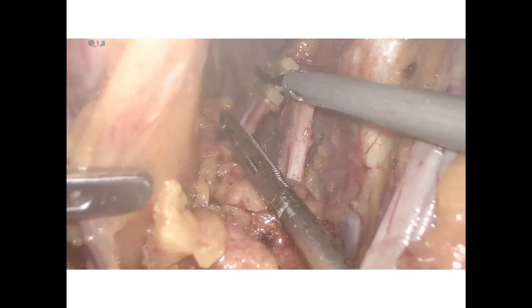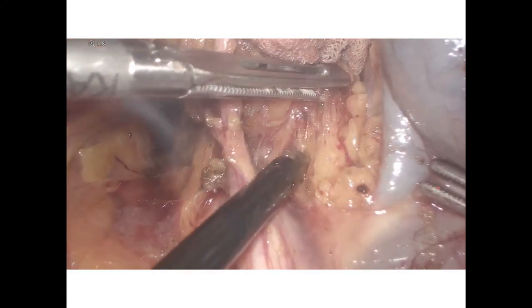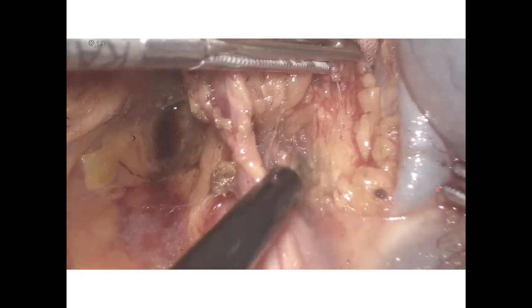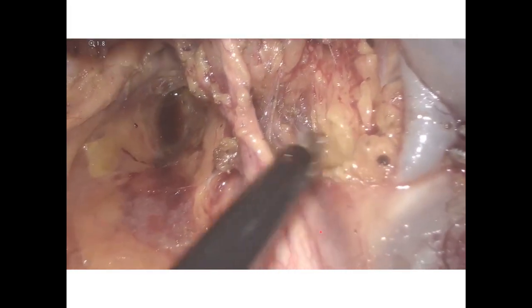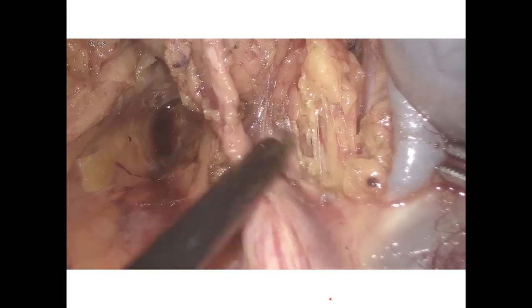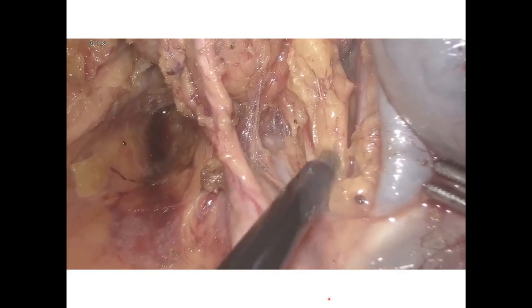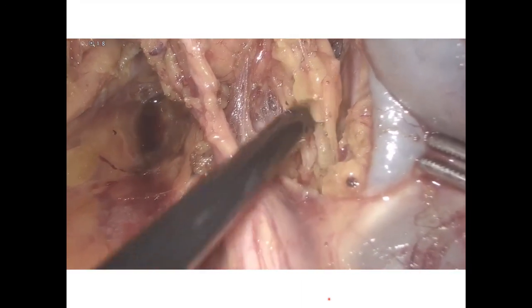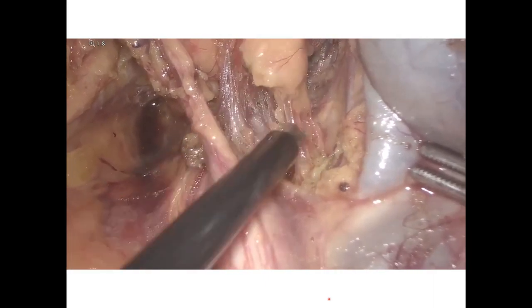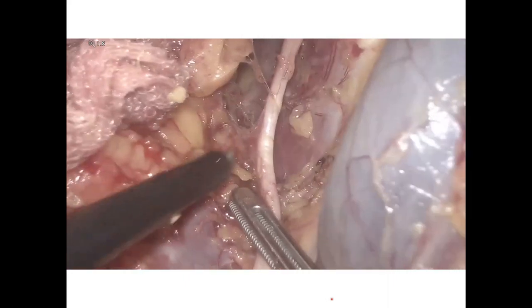The distal side of the obturator vessels were divided. This is the proximal side. We can see the external iliac vein. I am trying to explore the surface of the internal iliac vein and looking for the proximal side of the obturator nerve. Taking care of sudden movement of the leg due to stimulation of the obturator nerve, I found the proximal side of the obturator nerve. The obturator nerve was dissected and preserved.